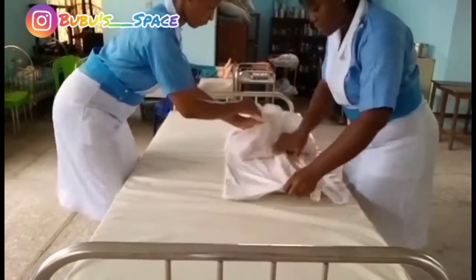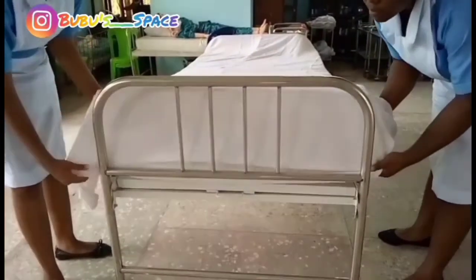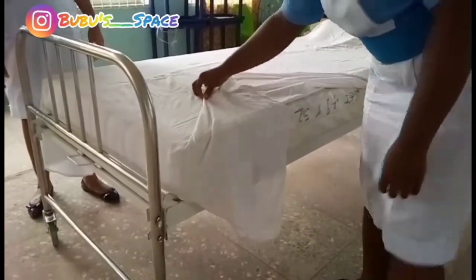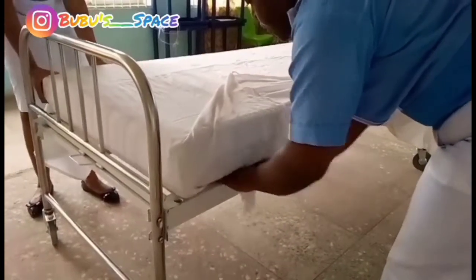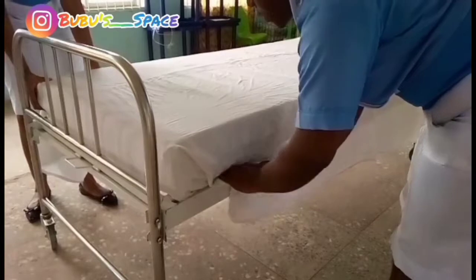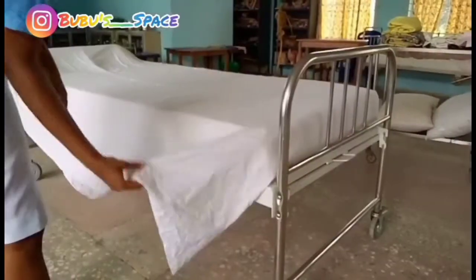We are going to be starting from the foundation bed. All the beds we do, we start from the foundation bed. As you can see, we are about to do the envelope corners — remember your envelope corner from the previous video. This post-operative bed is a two-nurse procedure.